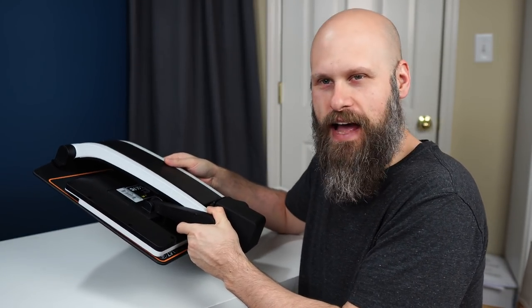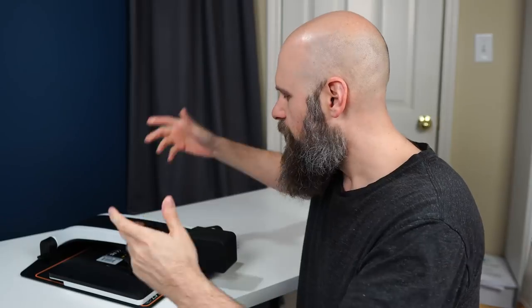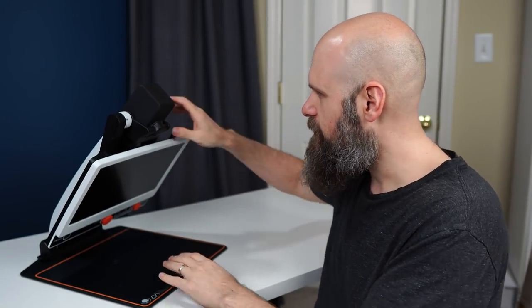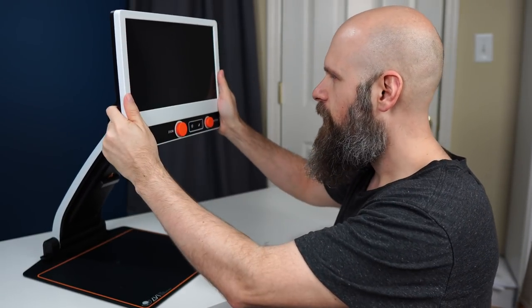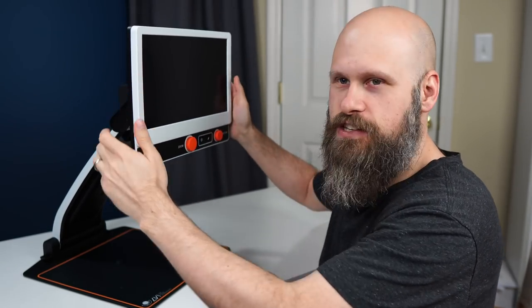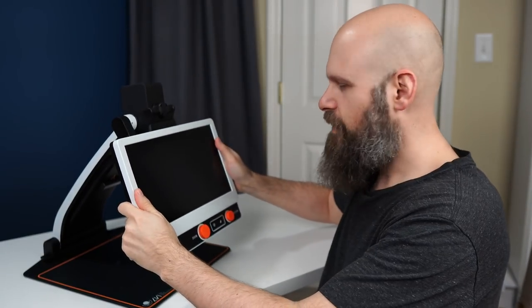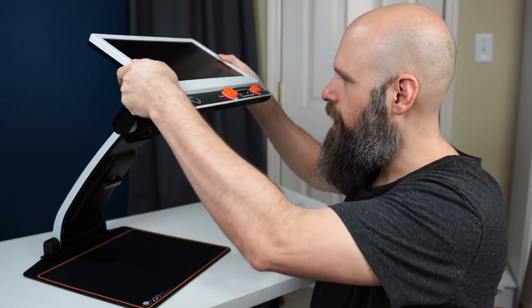I believe they said it's right around 10 pounds, so easy to carry around wherever you need to take it. When you want to open it up, it's very simple. Place your hand on the bottom tray and lift up until it clicks into place. Then bring your screen around all the way up until you hear the click of the camera popping into position. Once it's in position, you can adjust the screen wherever you need it — and the camera doesn't move.